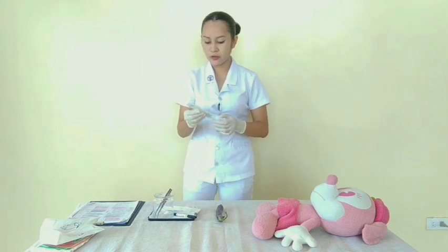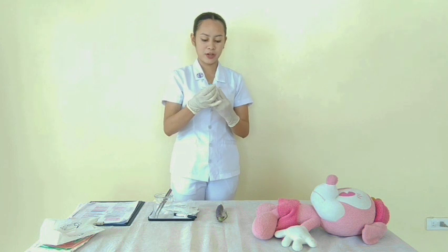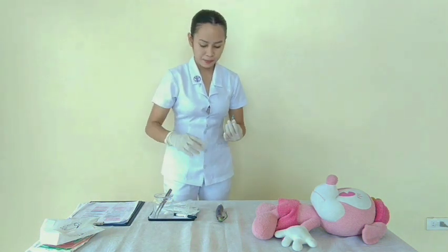So I'm going to remove the cap of the needle and expel any air bubbles from the syringe by tapping it. Now, grasp the syringe in your dominant hand, which is my right hand, holding it between the thumb and the forefinger. Then hold the needle almost parallel to the skin surface with the bevel of the needle up.